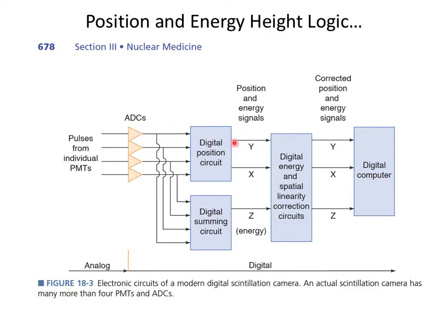And then you can use the ratio of the signals from the different PMTs to decide where, not exactly, but where the event occurred. So if I see 4 PMTs go off and they're all absolutely equal, then you know essentially the event probably occurred in between them all, right? So you do a spatial averaging and say, okay, I'm going to put that event right between y'all.